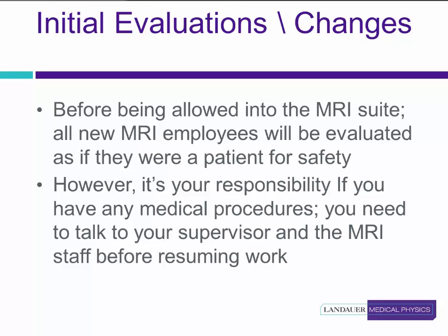Optimally, you'll want to work in the scanner room when a technologist is present. This will allow another set of eyes to ensure there aren't any problems. Of course, this is the optimal situation and doesn't always happen. If you have to go into the suite without a technologist present, it's very strongly recommended that you alert or have others watch you and let them know of your timing. How long do you expect your job in the suite to take? Your facility may require you to have someone observe you, or you may only be allowed to work in the MRI suite while technologists are present. They're only there for your protection.